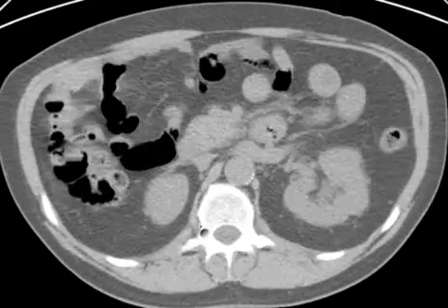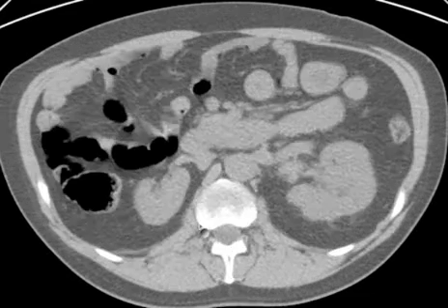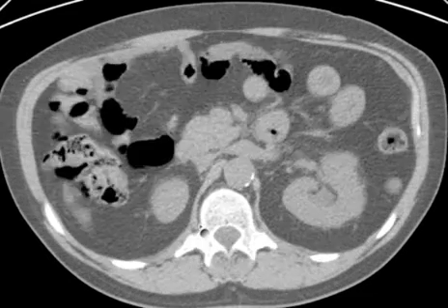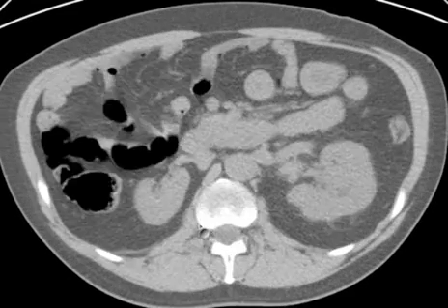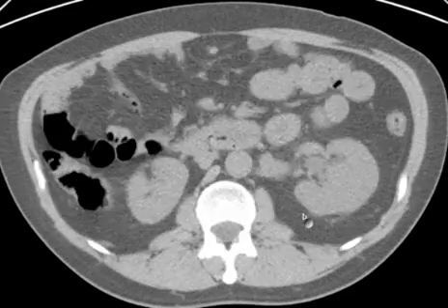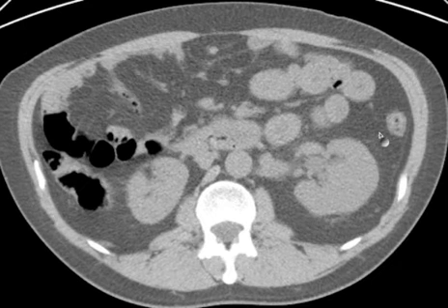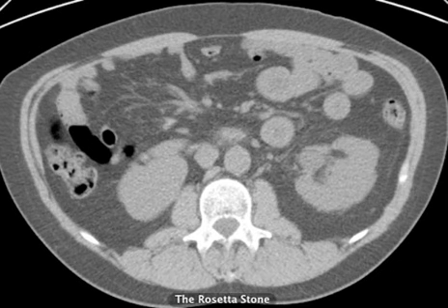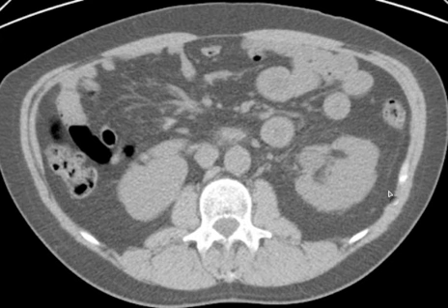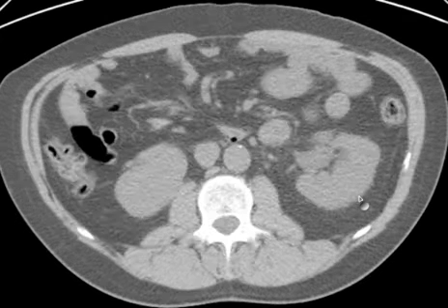Look at the left side. This is a typical appearance of mild hydronephrosis with some perinephric stranding. It's subtle, but you can see a little stranding around this kidney compared with the right. Sometimes people have just little lines — that's probably fibrosis or just thickening of the fascia a little bit.